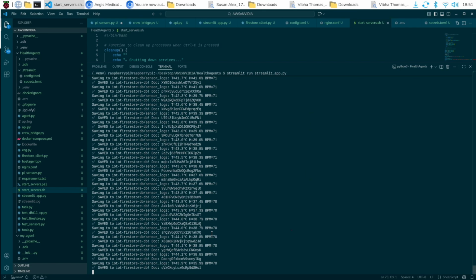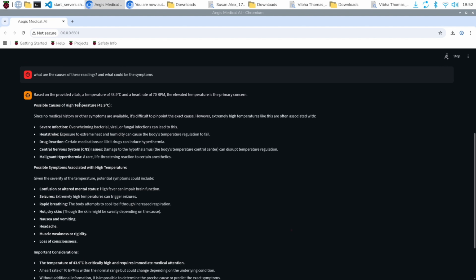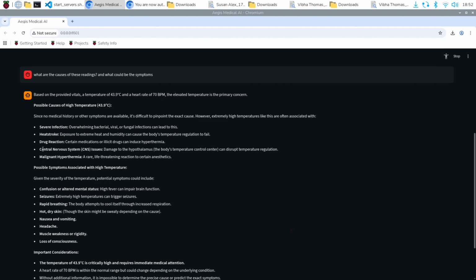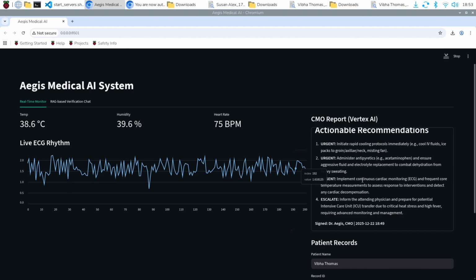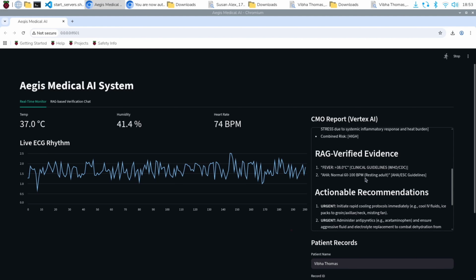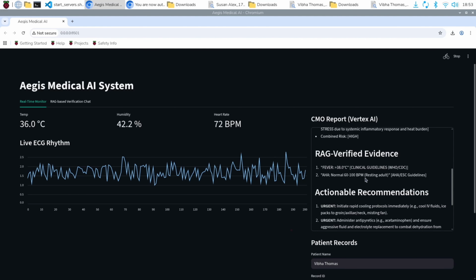When you notice, this is not being run locally. We're actually using the Vertex AI RAG engine that Google has provided, and we've come up with a great response, where it says that the temperature is really high, but your heartbeat is pretty normal. You can possibly have a severe infection, headache, and these are the symptoms, and it's a beautiful output. So this is basically the entire project demonstration that I've done, and tried to simulate normal readings.